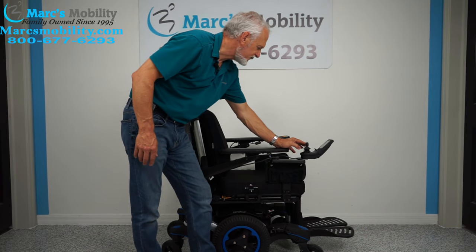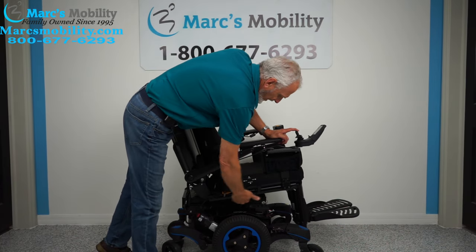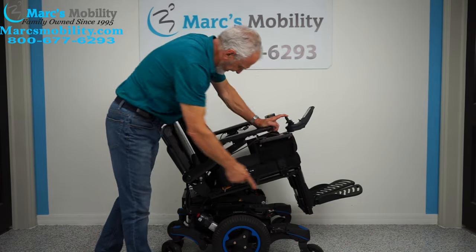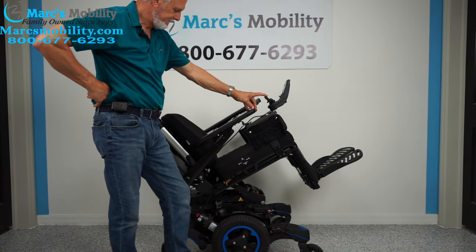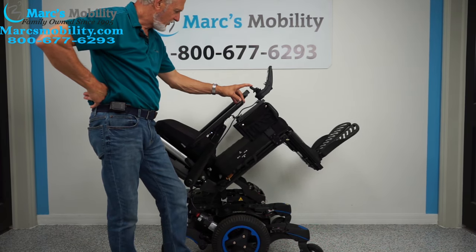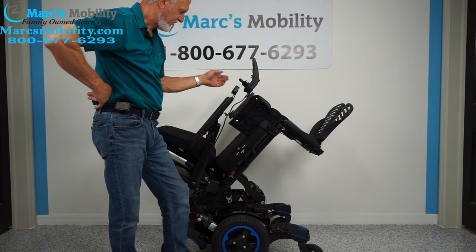The second most popular function is the electric tilt. When the base tilts back, it takes the legs and the back with it — they're all connected together. This gives you good circulation.